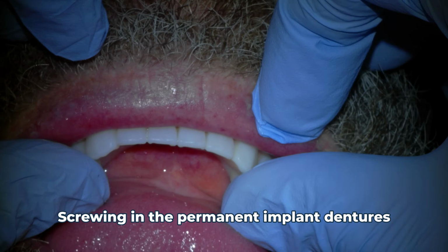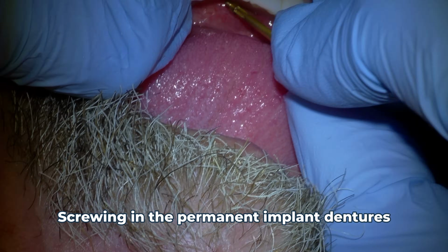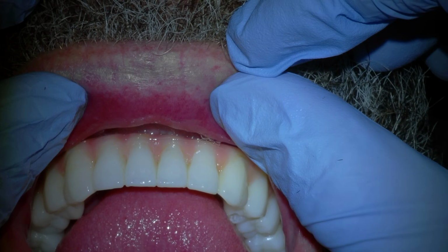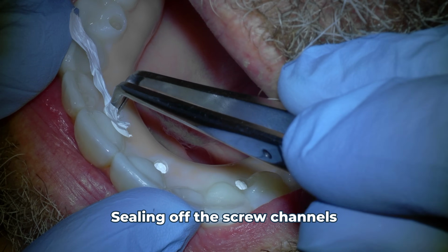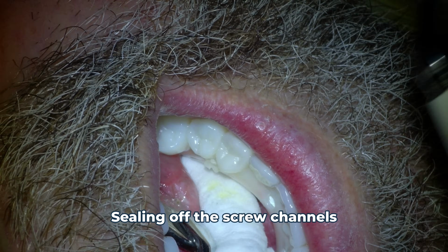And so just like before, we tightly place these screws in there, and then we put that protecting Teflon over each of the screws in case we ever have to drill and open the screw channels again, which you likely will at some point have to do. Then we just seal off these screw channels with composite.